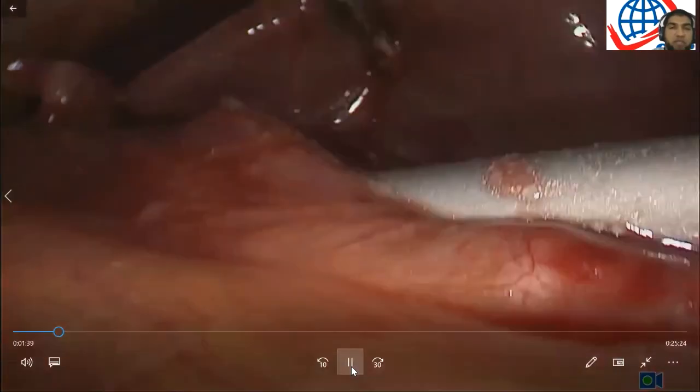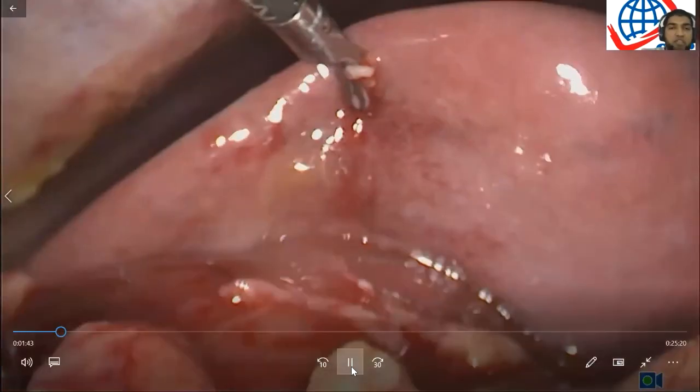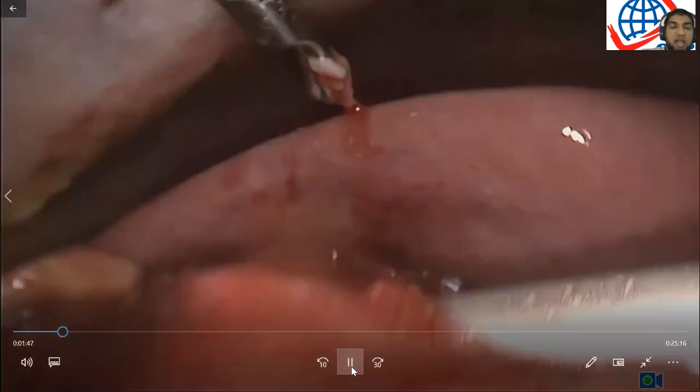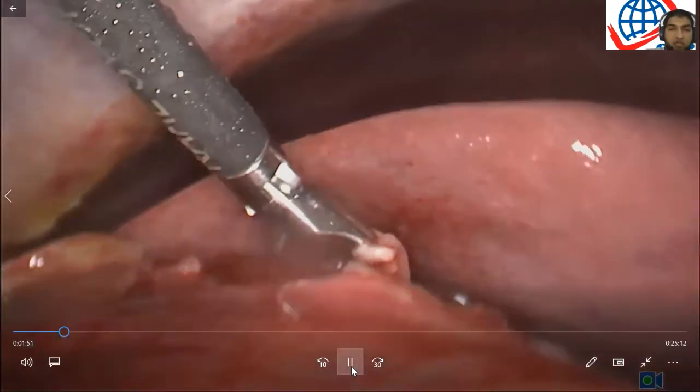It's very difficult to elevate this area initially because you have a very distended gallbladder and it's difficult to grasp. So because it's difficult to grasp, the trick at this point is to continue your dissection as gently and with blunt dissection as possible until such time that you can at least see much of the gallbladder.